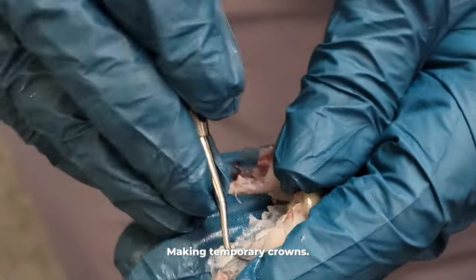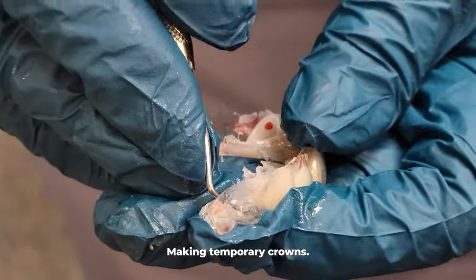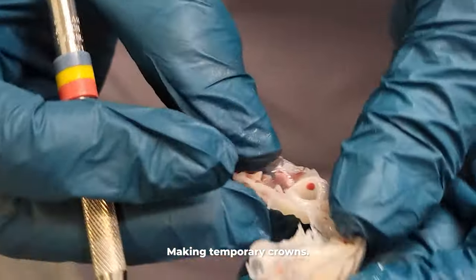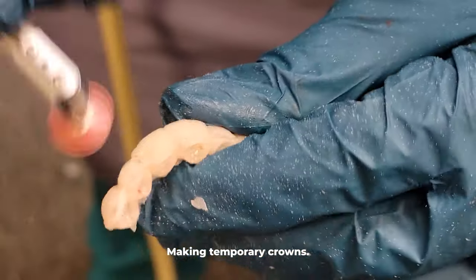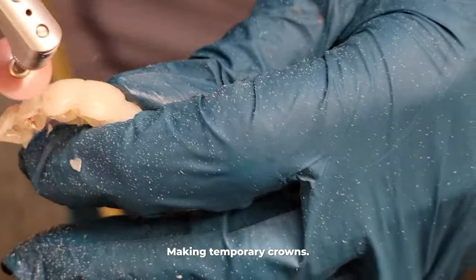Since these temporary crowns are fashioned after the old teeth, we want them just to get us by until we get the final crowns in a few weeks. And because this template was fashioned after his original teeth, these temporary crowns won't be cosmetic yet.